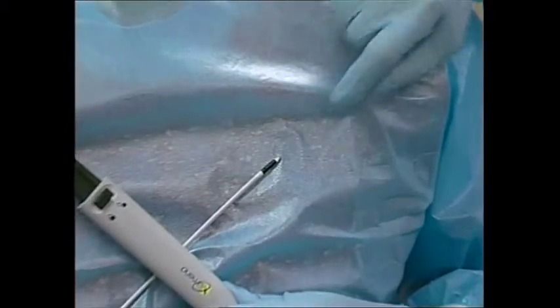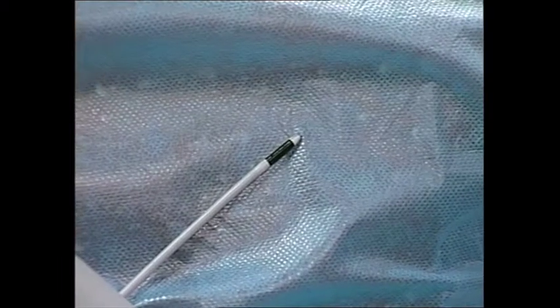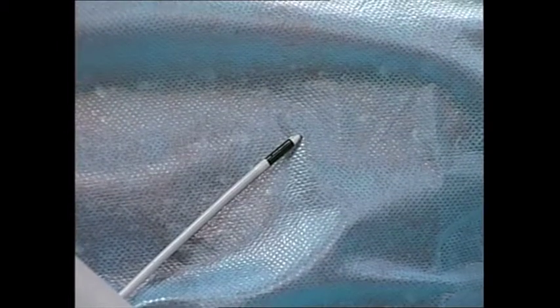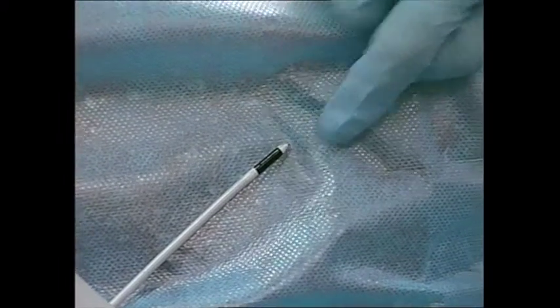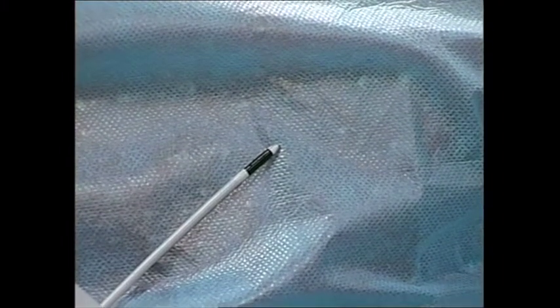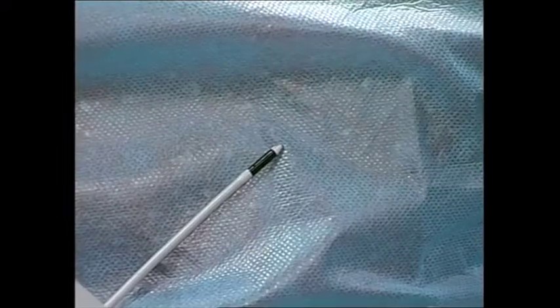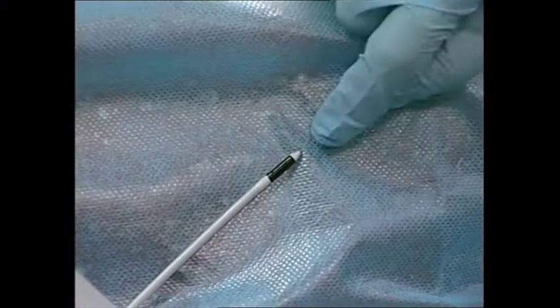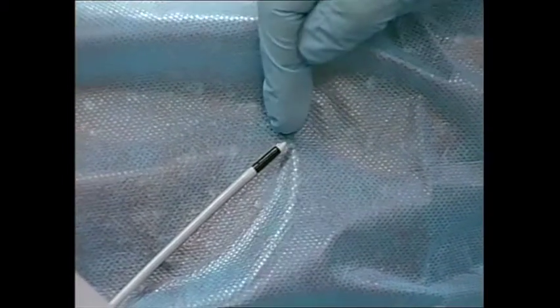So this is the hot tip, and the tip is ceramic, and it is conical or bullet shaped, so it tapers towards the tip. So it's acting actually like a dilating bougie. But along the tip here is a fine diathermic wire. And that wire delivers cautery, and that wire is extremely fine and actually wraps around the very tip of the catheter in a ring-like fashion. So you're going to get cautery at the very tip and along the side of the tapered bougie tip.